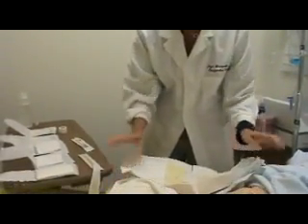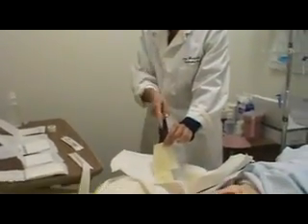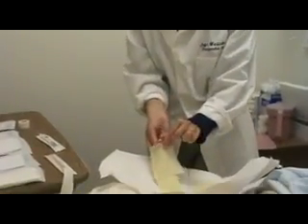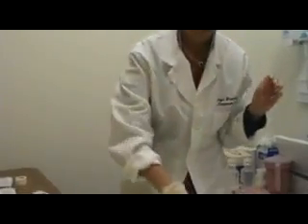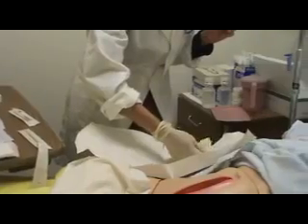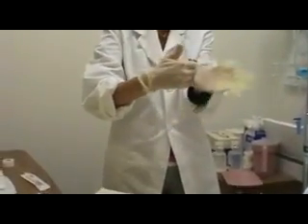All right, so I'm a righty. I'm going to put my right glove on first. I touch the cuff, the outer aspect, which ends up being the inner aspect of the cuff, with my left hand, and I slide my right hand in the glove. And then I will go inside the cuff with my sterile hand, because sterile is going to touch sterile, and slide my other hand in. Okay, so I can pick my package up and toss that in the garbage as well.